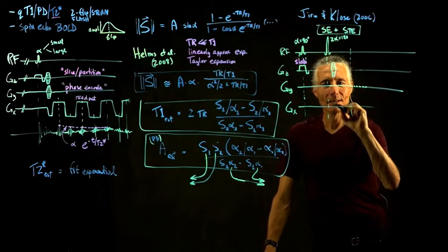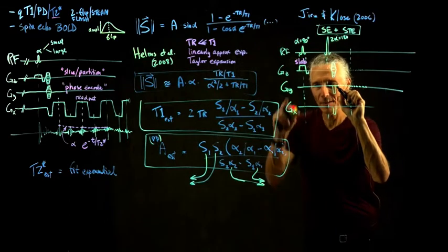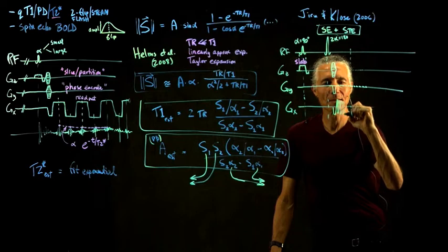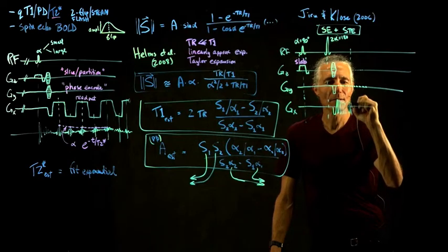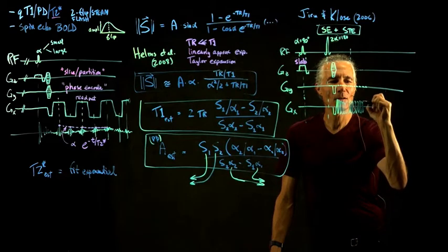here we are. We go to the corner of K-space, and we also have to go to the corner of K-space in the phase encode direction. And then we start doing our echo planar readout, and I've just compressed it in time. And then here's where we reach the center of K-space with the gradient echo, but also a spin echo.